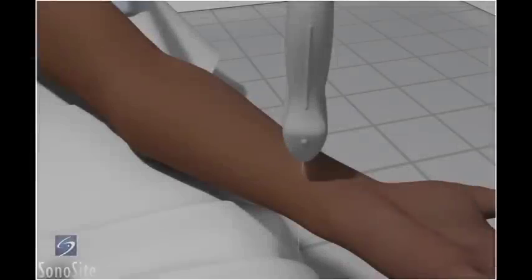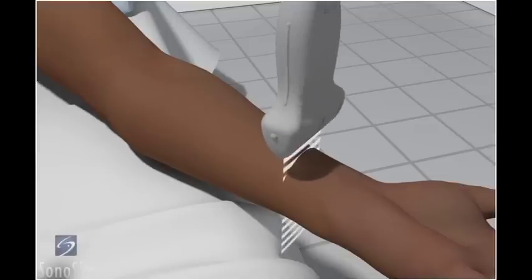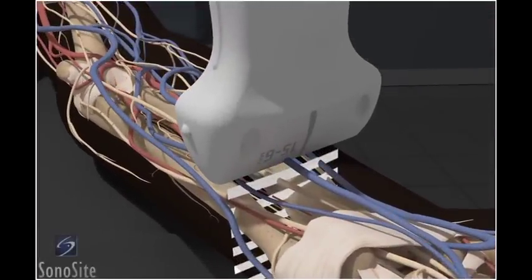The patient is placed supine with the arm externally rotated at the side. The transducer is placed in a transverse plane at the wrist crease with the orientation marker directed towards the patient's right side.